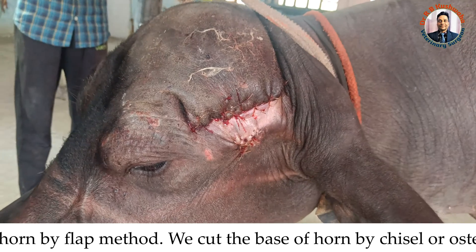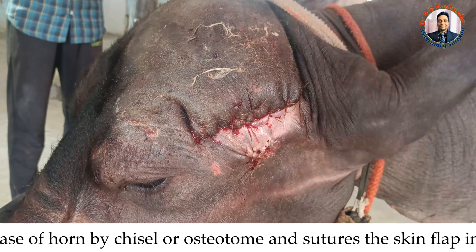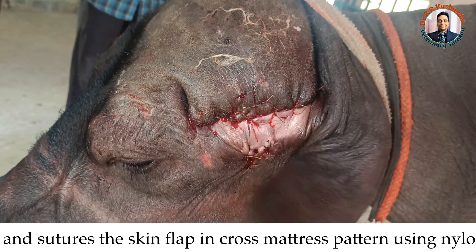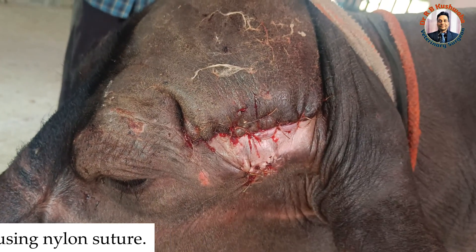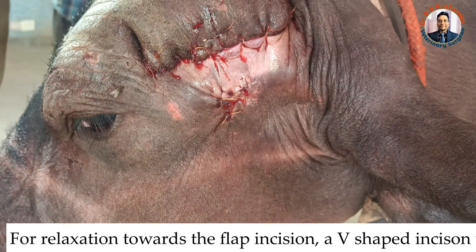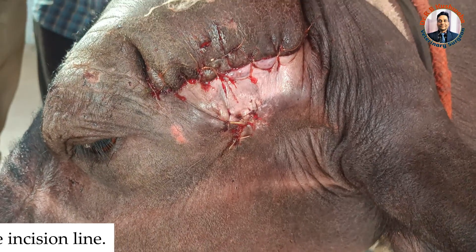This amputation was performed by the flap method. You can only perform this by flap when you remove the base of the horn close to the frontal bone. Here I performed a V-shape incision just below the skin incision for relaxation.